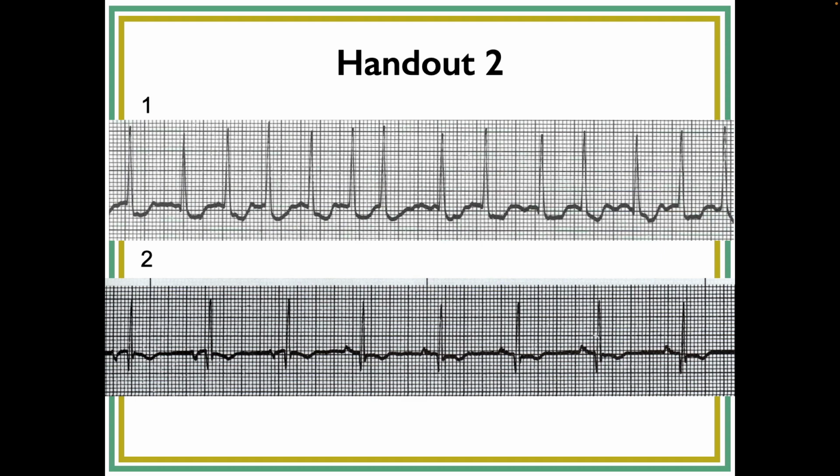Now, P waves. So, I see alternating P waves. So what are you calling P waves? I mean, is that more of like those? Okay. So you sort of see P waves, but they look really different. So let me suggest to you, these are not P waves.